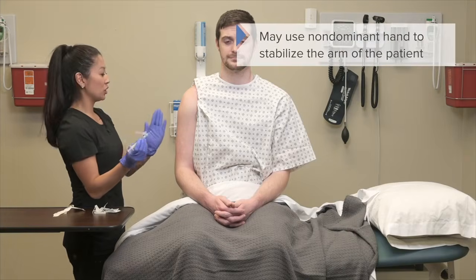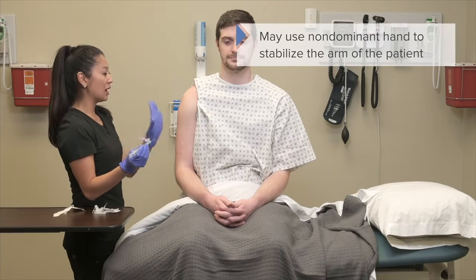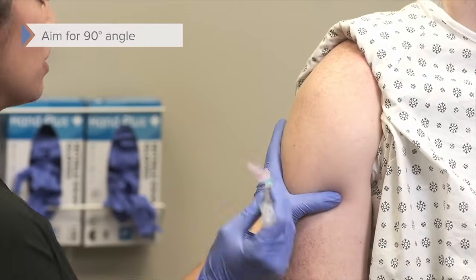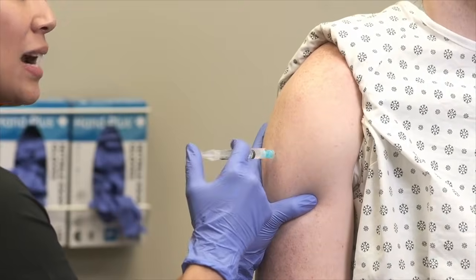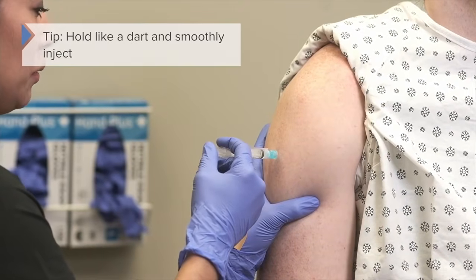All right, so when I go to give the injection, I like to put my other non-dominant hand here, position myself straight with the arm. I like to take the non-dominant hand and really support the muscle, which also stabilizes me. And then I'm going to go in at a 90-degree angle. Okay, sir, go ahead and take a deep breath out, and I'm going to give the injection. Notice that I darted in all the way to the hub. I'm going to inject the medication.